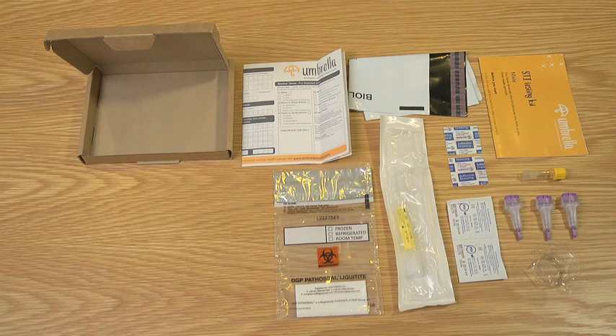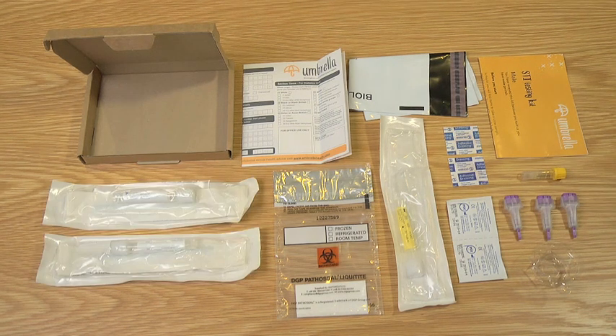All of these items are also in the kit labelled MB. However, the MB kit also contains 2 packets containing cotton bud swabs and thin sample tubes with white labels. These are used to collect samples from your rectum, which is your bottom, and from your mouth.